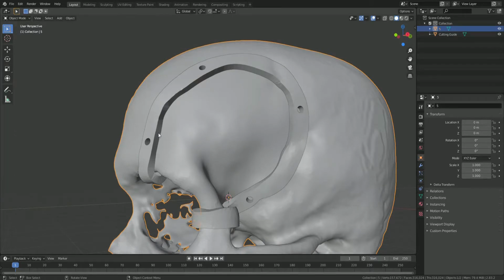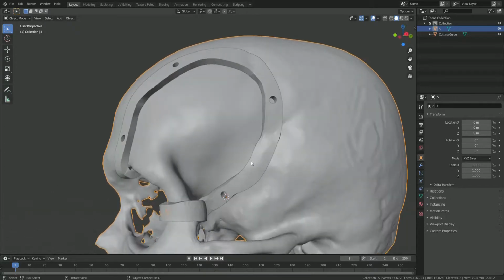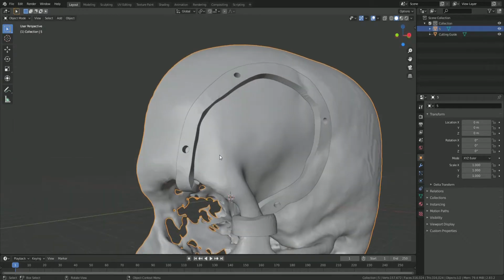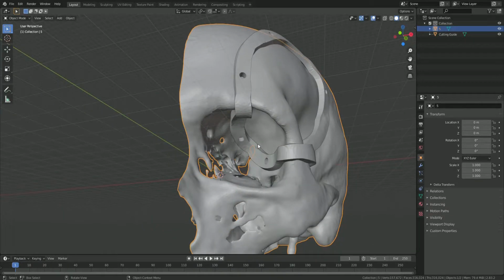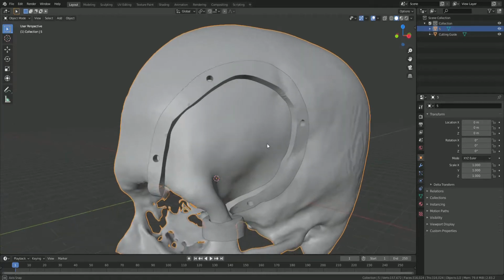It didn't go. Then I tried to make just a plane. Again, it was too hard. It didn't turn out well. I thought that maybe first I should make a defect, and according to the defect I should make a guide. So I was thinking of starting it all over again.